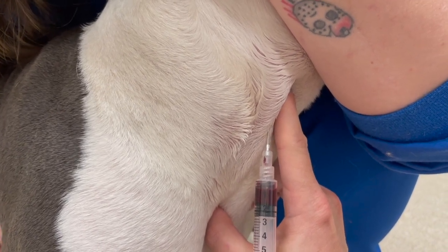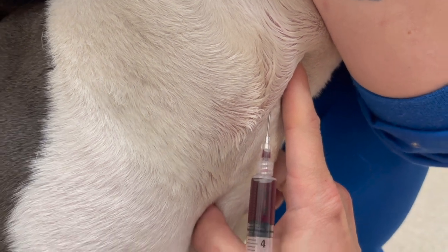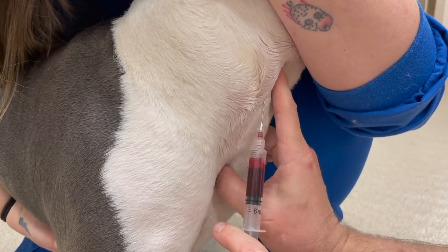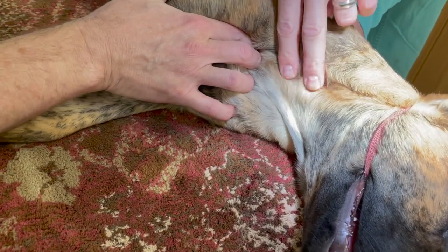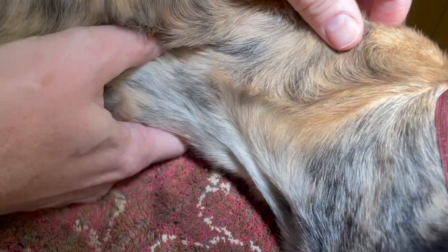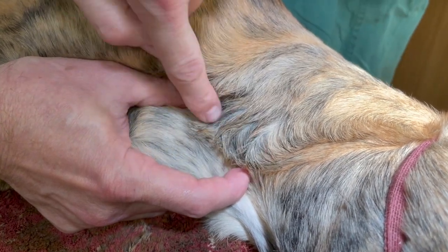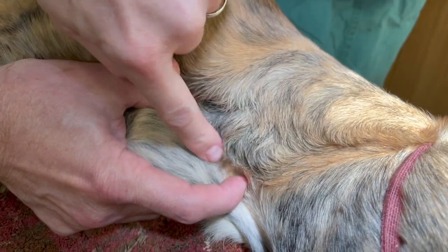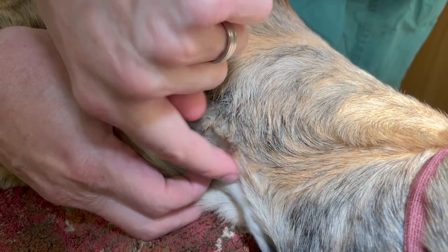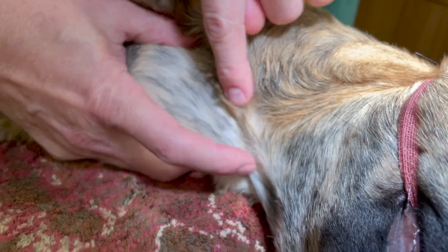There — you can see it's starting to flow. It's in a nice position now; I'll try to hold that tip exactly where it is and move with the dog if I need to, because this one's very positional. That's all I'm going to get — that's all I need. You can see it kind of rolling — it's bouncing right there; that's her vein. So what landmarks are you using? It's in this jugular furrow — there's a muscle along the edge here and a muscle here, and there's like a furrow or a gully or a groove right there, and it sits right in there. The trachea is right here in the middle, so a lot of times I put my finger on the trachea and know that the vein is over to the side of that, and then I can feel it.